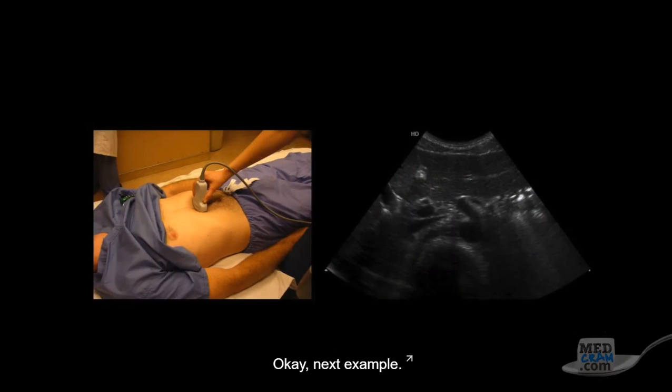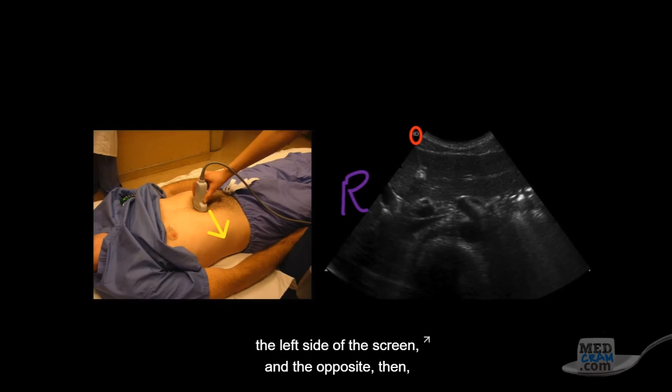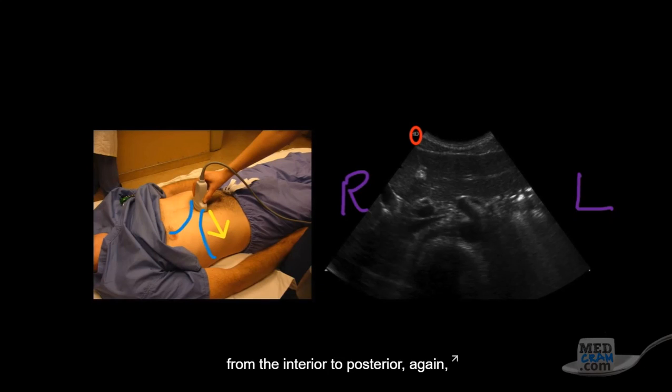Okay, next example. We see on our patient on the left here that our indicator is pointing towards the patient's right. And our indicator on our screen is on the left side of the screen. That lets us know that the patient's right is on the left side of the screen, and the opposite then, the patient's left, is on the right side of the screen. And then we see that our ultrasound beam is shining from anterior to posterior again.